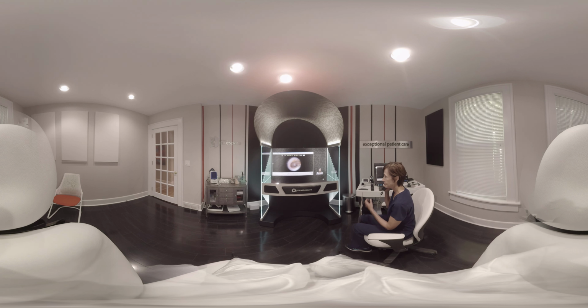For me, this is nothing very exciting. This is just a normal image that I see all the time, although it is very clear and allows me to make a good diagnosis. For the patient, this is something unique. Most of us have never seen the inside of our own ears or the backs of our own throats. And so this really empowers patients to be members of the healthcare team here and to help them understand why we're making the decisions we're making about their health.